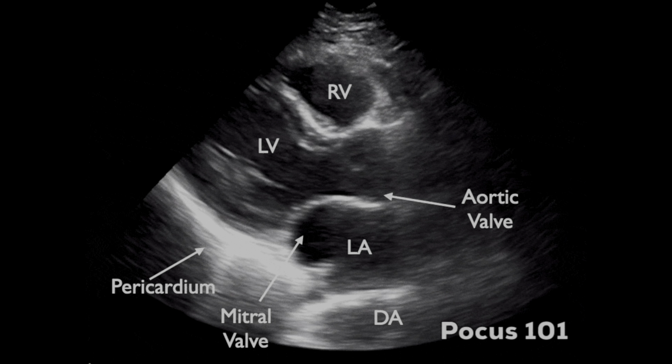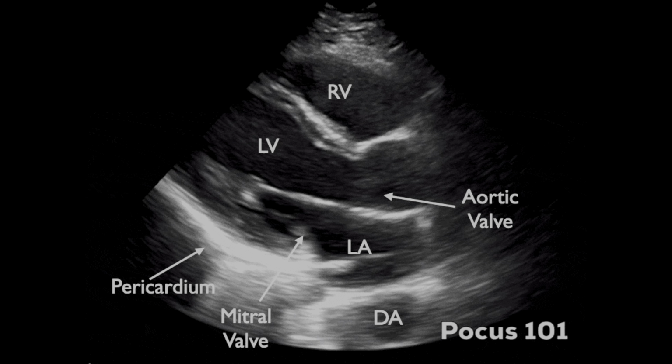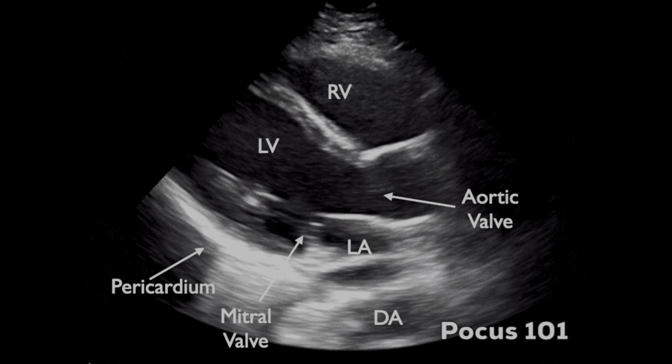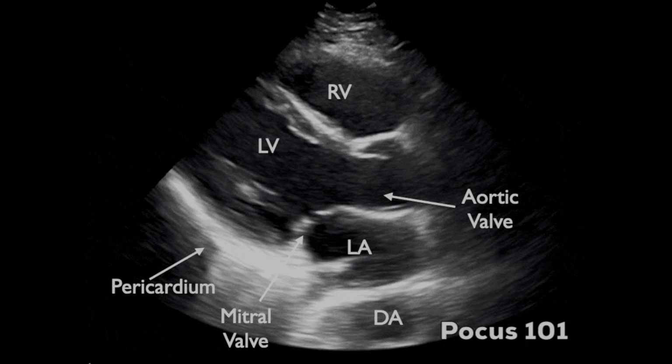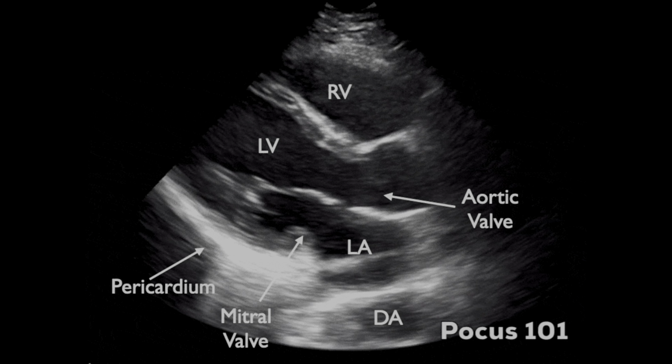In emergency practice, parasternal long axis view is extremely useful. It allows you to assess left ventricular size and contractility, look for gross valvular abnormalities, and identify pericardial effusion. It also helps you judge whether the left ventricle is dilated or underfilled, which is crucial in shock states.